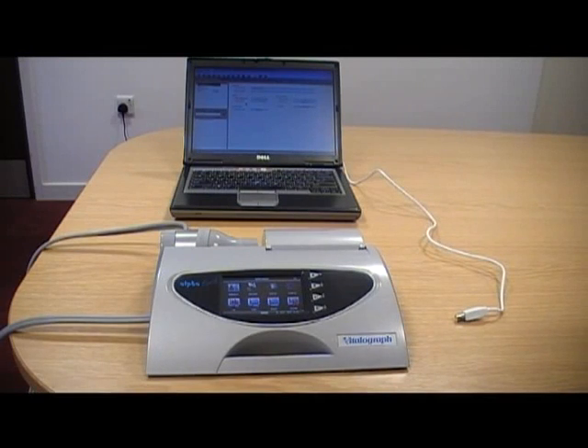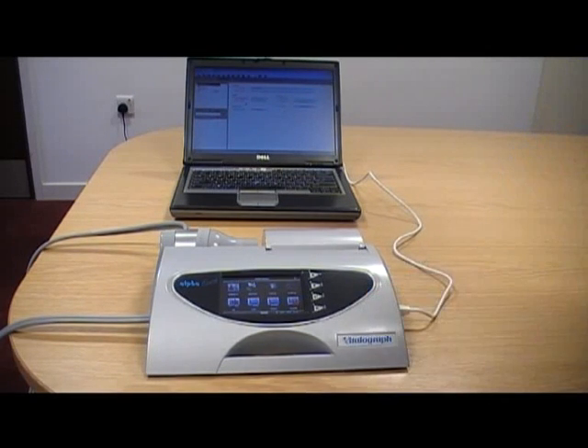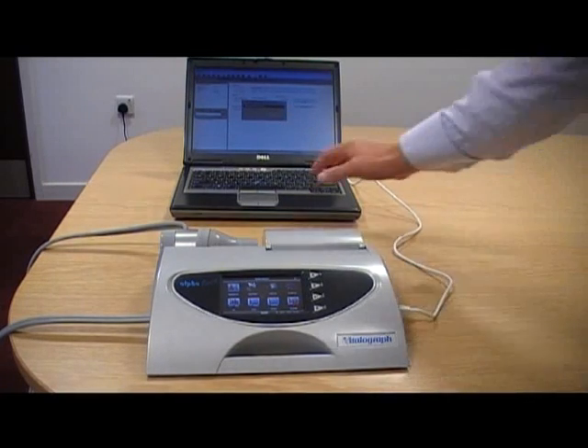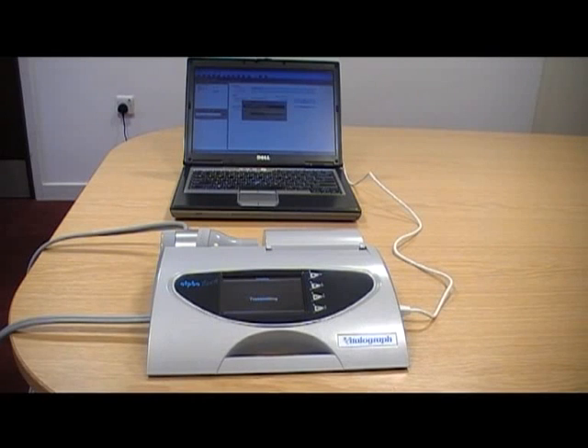To download your results into the Spirotrack software on the PC, switch the AlphaTouch on ensuring it is displaying the main menu. Once the main menu is displayed, connect the AlphaTouch to the laptop. Spirotrack will automatically display a transfer dialog box. Click start on the box to begin the data transfer. Your data will be transferred from the AlphaTouch into the Spirotrack software's database. The data is automatically synchronised.